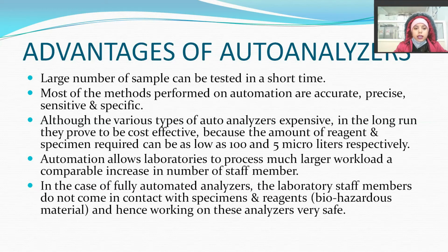Automation allows laboratories to process a much larger workload without a comparable increase in the number of staff members. Then, in the case of fully automated analyzers, the laboratory staff members do not come in contact with specimens and reagents, that is biohazardous material, and hence working on these analyzers is very safe.